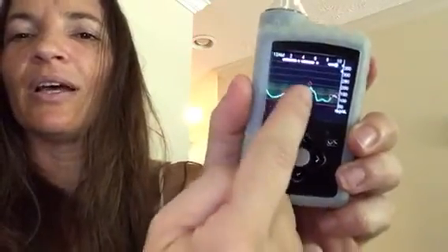I figured out I have 2 overnight patterns. There's more, but 2 really the main ones. And one is where I don't get very much insulin around 12 a.m., let's say, which means that by 3 a.m., my blood sugar is rising and then auto's giving me a lot of insulin, which means that when I wake up at 6 a.m., I'm going into my morning with a lot of insulin on board. And then I plummet. You can see at exactly 6 a.m., all of those right there are big micros. So I plummet when I get up. That's actually my second pattern. It's not my more common one.